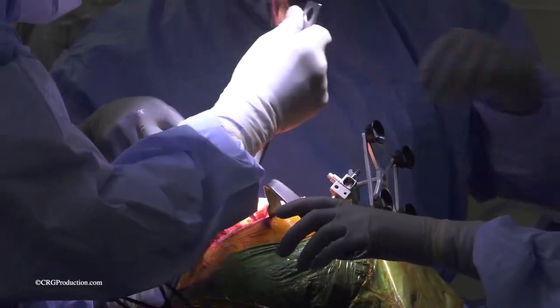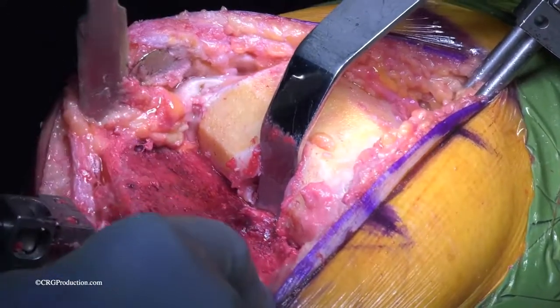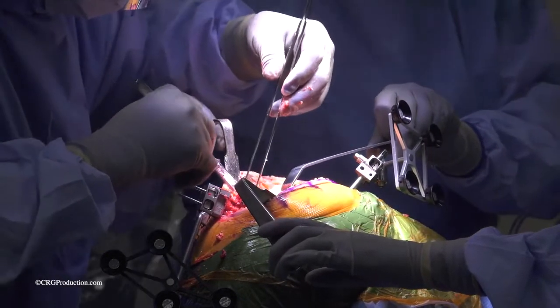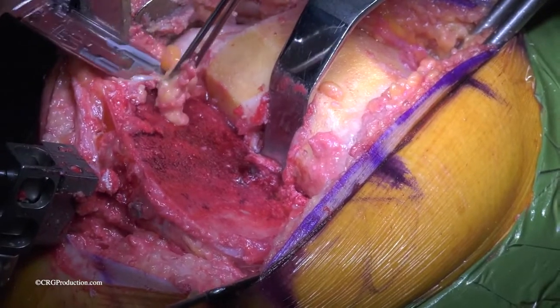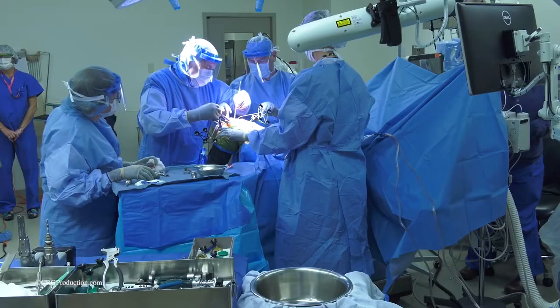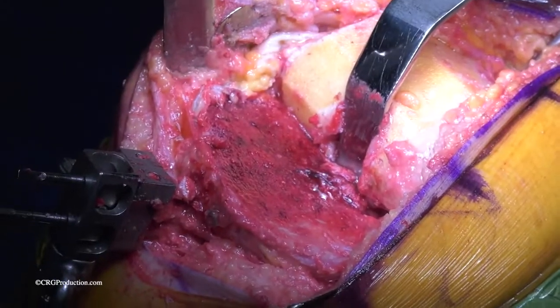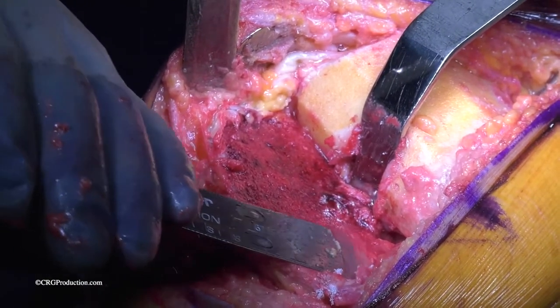So we know what size we're using for the femur. Now we have to double check the top of the tibia, the shin bone. Retractors are inserted perfectly in place so that we can really see where our bone surface is. Sharp dissection is used about the knee so that we really can see the top of it, medial to lateral. The saw is used just to clean up edges to ensure a perfectly smooth surface.